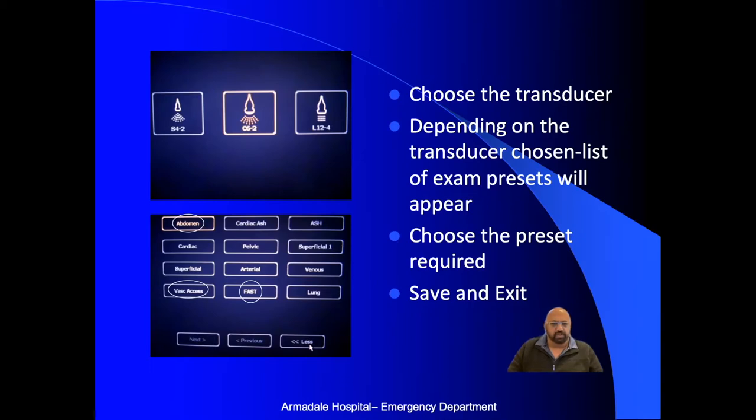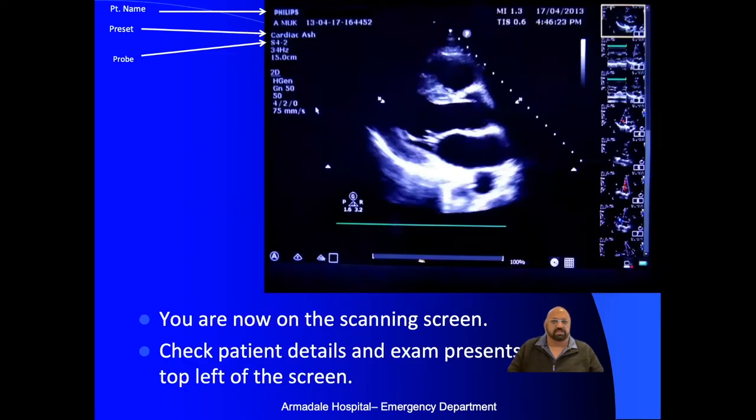Once you've chosen all this, the next screen will tell you to save and exit. Save and exit, and you come to the main screen. The patient's name should appear just next to Philips, the person performing will come up here, your chosen preset should appear, and the probe will be mentioned. Just check that those are the things you want to be using.